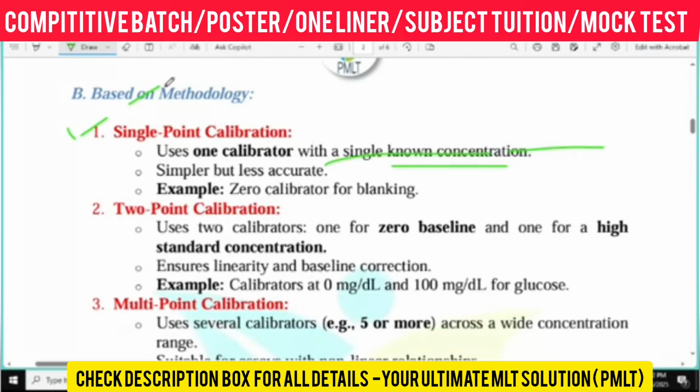Okay. An example is a zero calibrator for blanking. If you are measuring the blank in this particular instrument, then you might use one calibrator, that is a single point calibrator. Okay. That's all about single point calibration.